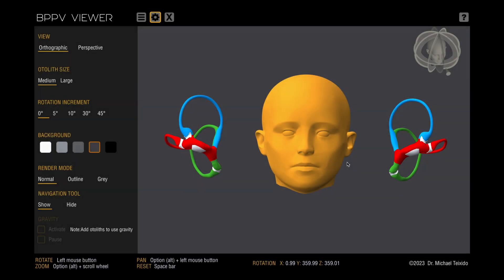Welcome to the BPPV Viewer, a downloadable tool for study of otolith disease. In this video, we will guide you through the viewer's features and help you make the most of it.